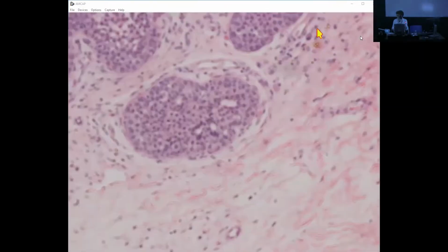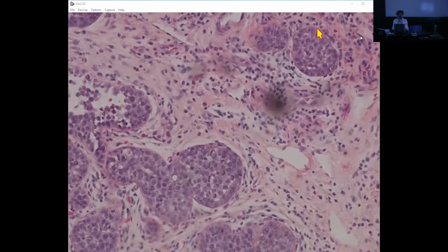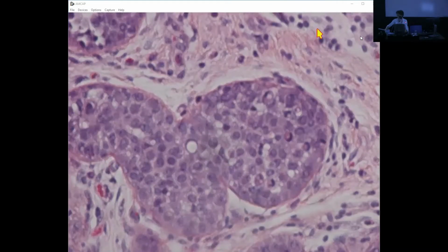Any questions about this case? No, it's pretty classic. I think they had a little bit of cytoplasm. Usually we don't say type A or type B. I think they are a little bit larger than usual. Yes, the nuclei are more open. They have more open chromatin. So yes, I would say type B cells.